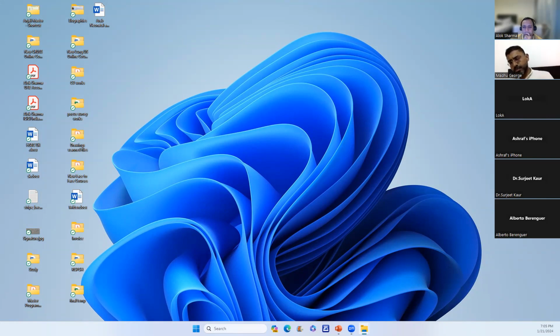Yeah, as you have told, we need to save 4 slides. So we need to save only the images which are pathological or of relevance? Yes. What I'd say is that if you start storing all the files in a comprehensive scan, and I'll talk about it today, it will have images that include anterolateral and posterior, which is R1 to R6, L1 to L6, 12, and then each intercostal space, anterior and posterior.